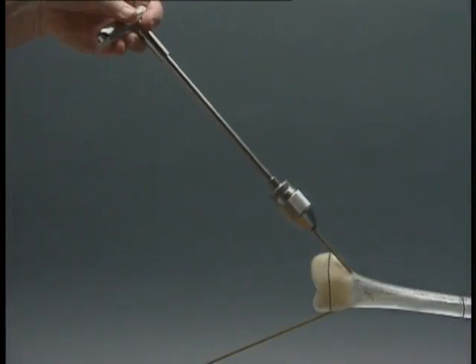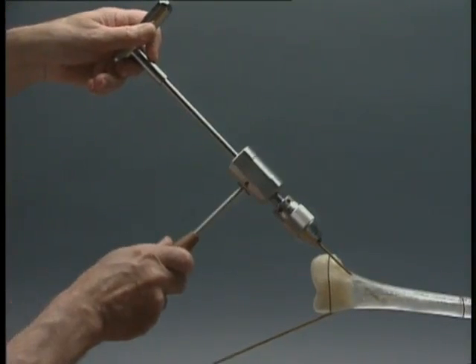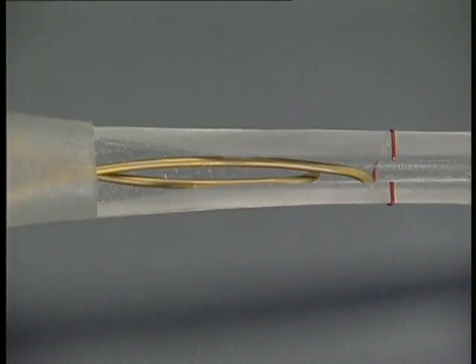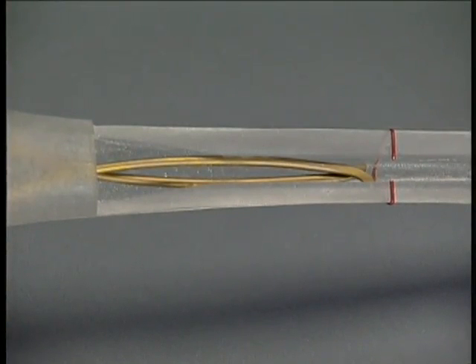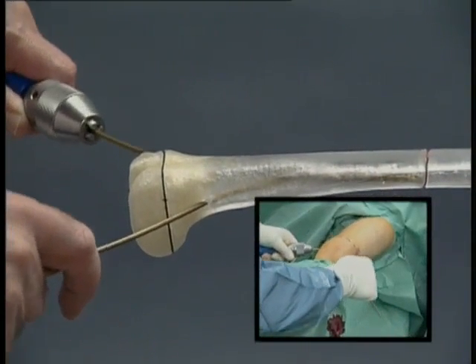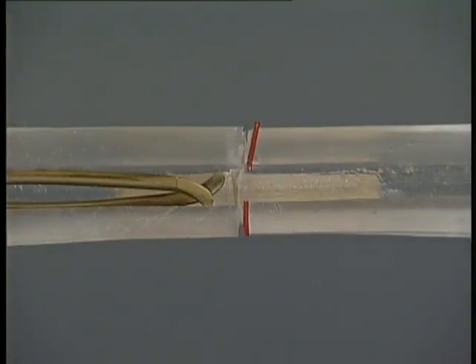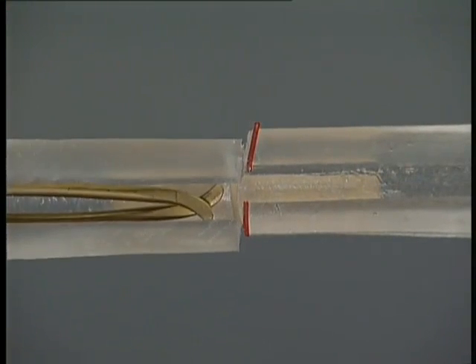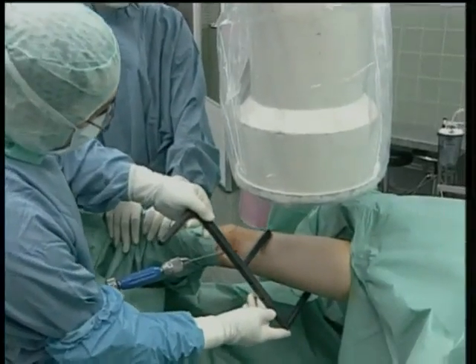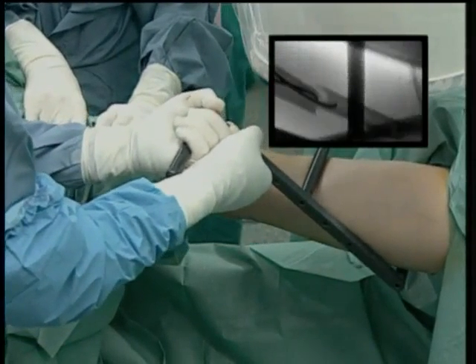The alignment of the nail tip parallel to the axis of the medullary cavity can be clearly seen. The second nail is advanced to the fracture zone. If insufficient reduction is achieved, especially with transverse fractures, the distal fragment can be manipulated and accurately reduced with the help of the protruding nails using the joystick technique. If this maneuver does not result in acceptable reduction, the small F tool may be used. If reduction is still insufficient to allow the nail to be advanced, a small incision must be made and an open reduction performed.